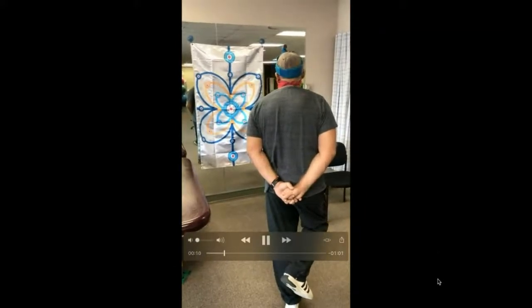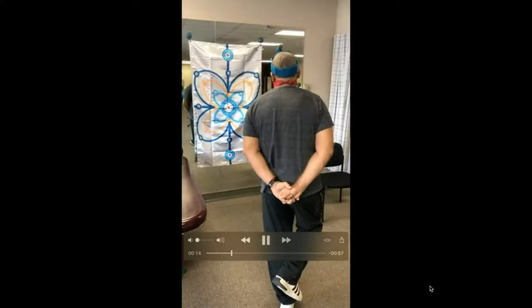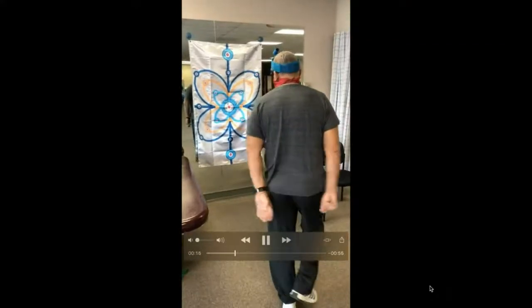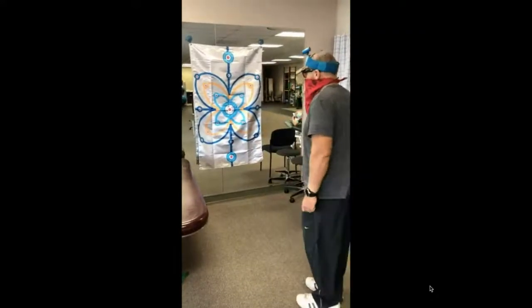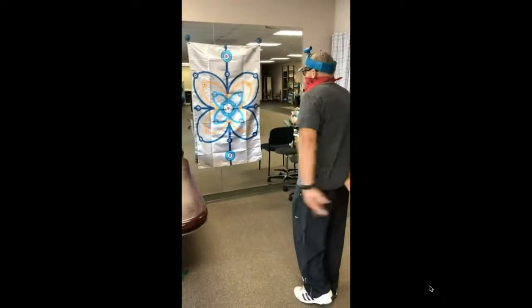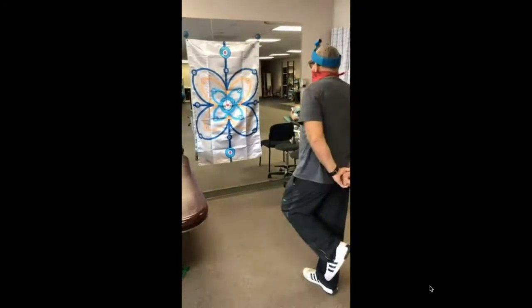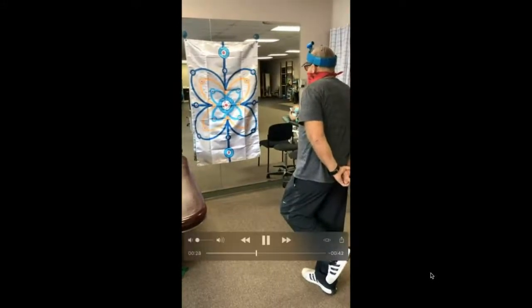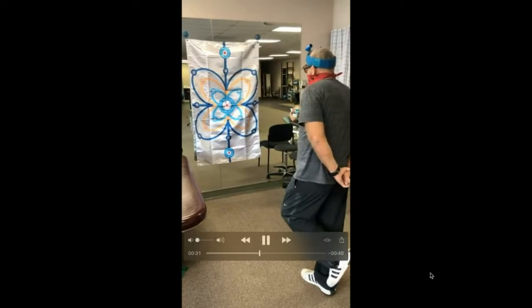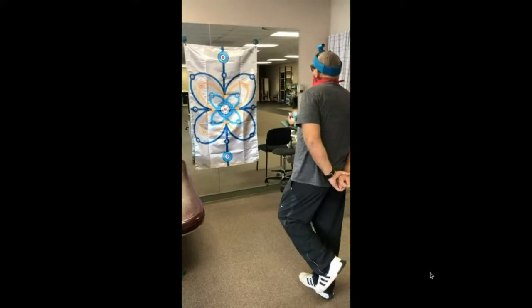So why would I want him to do this? As I challenge the system more and I narrow his base of support, we might see more decompensated activities there. And it's giving me a below and above axis representation here. So as he goes to the other side with 45 degrees, so he's pointed off axis, off the target with his torso, he can either do the small motions or he can do the large motions, which I think he's going to go through here.